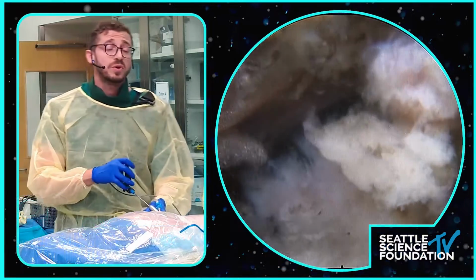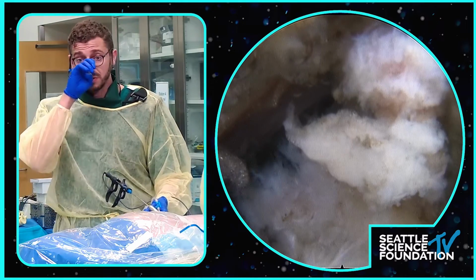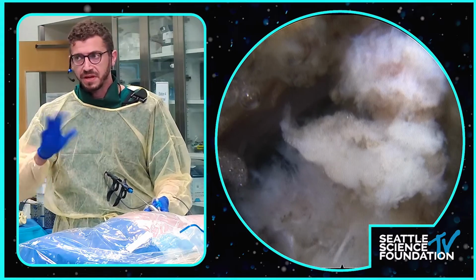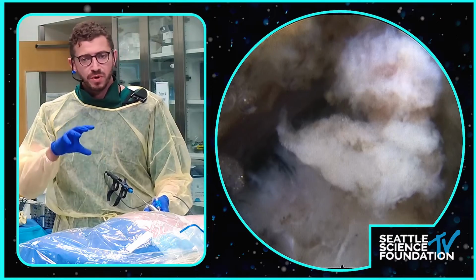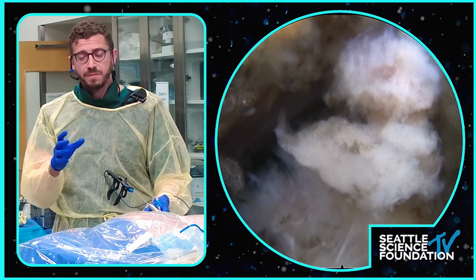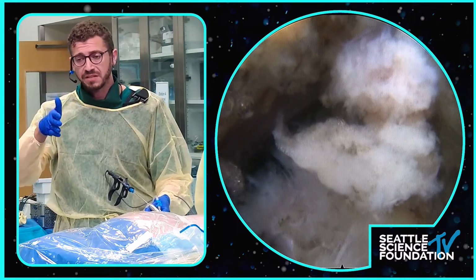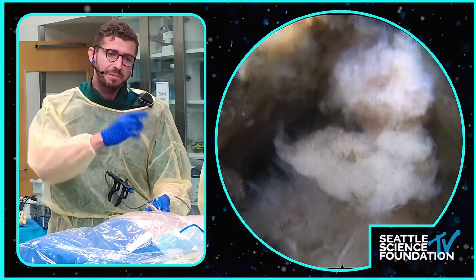So, as we know, a lot of times disc herniations get better on their own. The first thing you want to do is make sure you're at the correct level and the correct side, and that you're not at a place other than where you thought you would be. Reevaluate your MRI, make sure you're in the right place. Then, after you confirm all of that, make sure the nerve is completely decompressed from above the disc space, from the top end plate to the bottom end plate, and you see the pedicle.